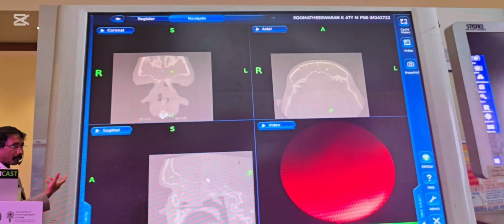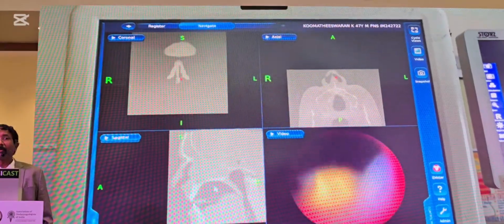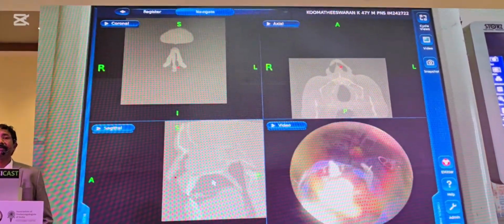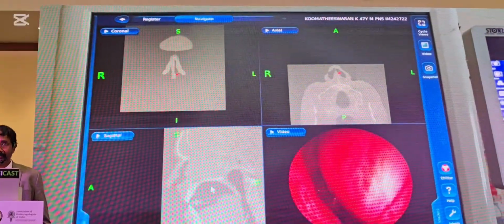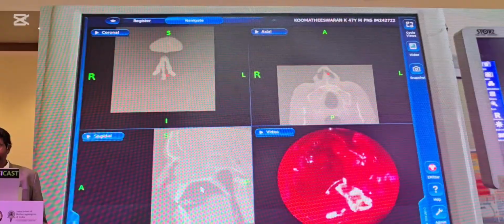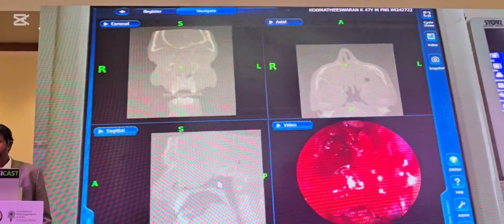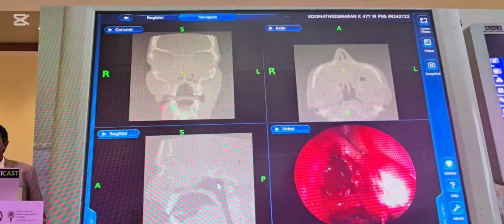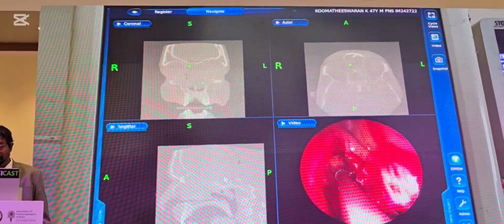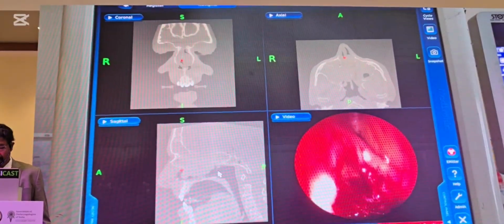So this area has been opened up, and it is confirmed before opening the frontal sinus when there is complete block. So this will be a device which you will be able to use, especially in revision surgeries and frontal sinus cases where you feel more confident, but still the anatomy plays a vital role and nothing can beat it. Even if the instrument may sometimes go wrong, you have to keep your antennas all around.